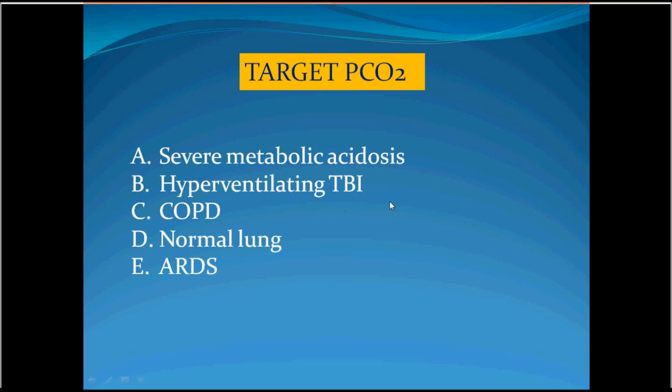And in this case, you are giving the maximum tolerated rate according to the expected time constant, and the maximum tidal volume according to the plateau pressure should not exceed 30. This is the maximum, and that's the maximum, and this minute volume is not sufficient to wash out carbon dioxide. You are allowed to enter into the formula of permissive hypercapnia.